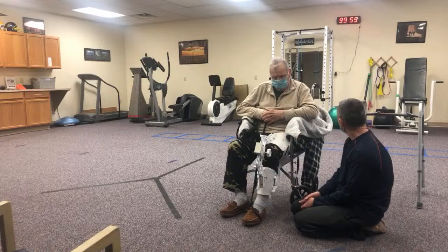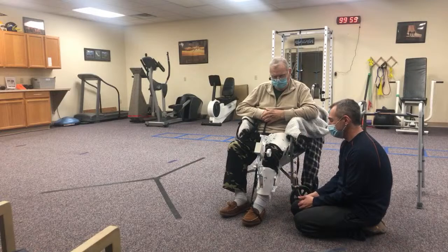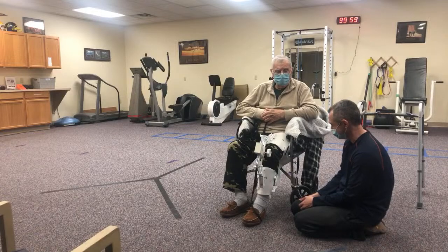We'll give it another minute or two - I'm watching the clock. This is a little bit like watching paint dry or watching grass grow, but that's what it is.